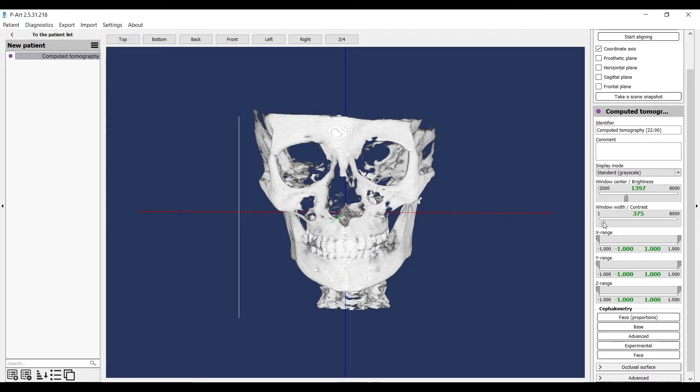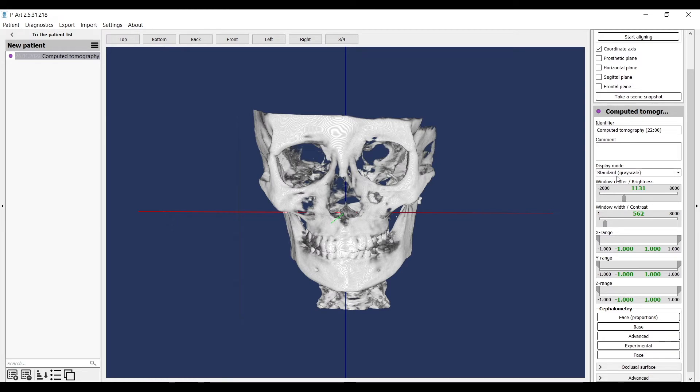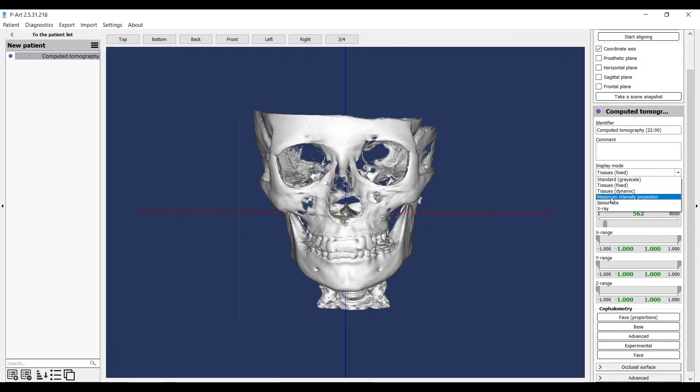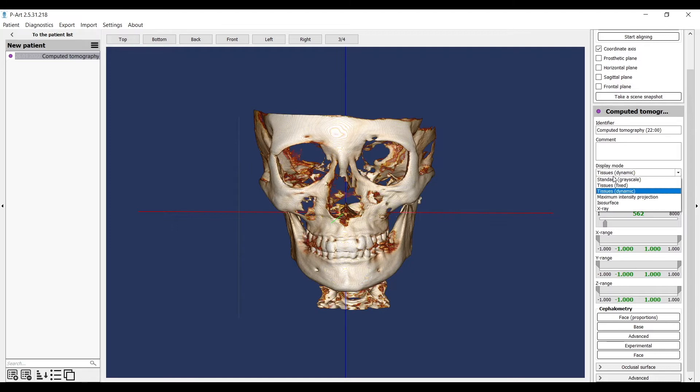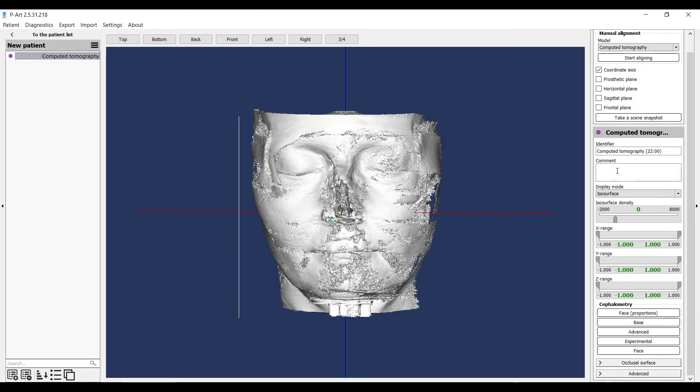You can try all display modes and find the most comfortable one to work with. Each mode can be configured according to the required parameters, usually brightness and contrast.